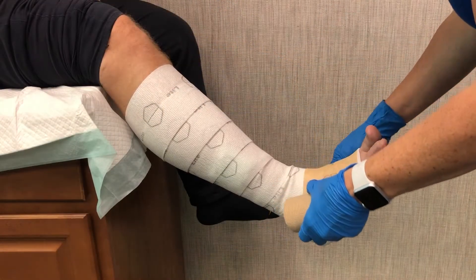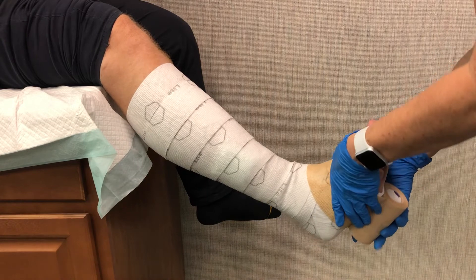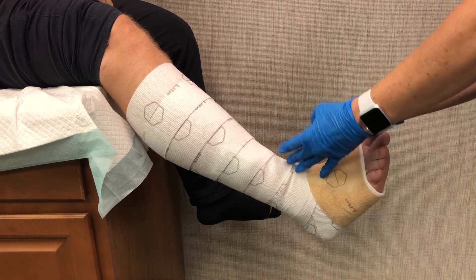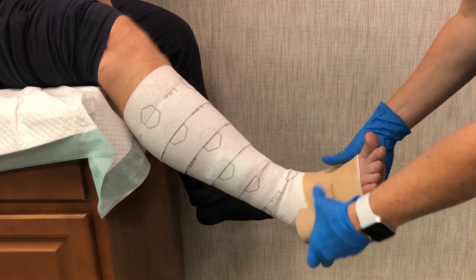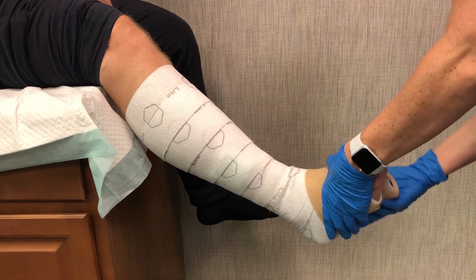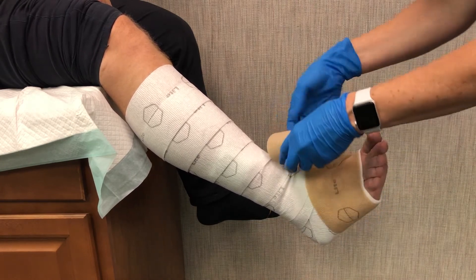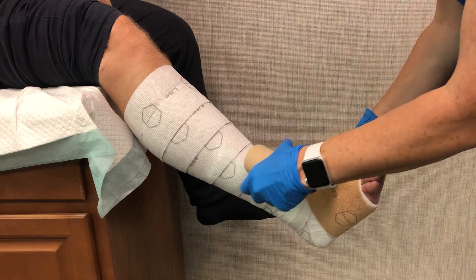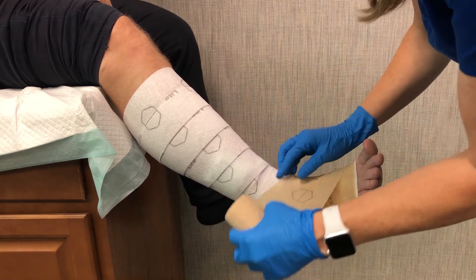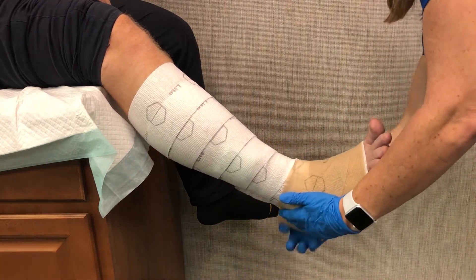Layer 2 is a cohesive elastic bandage which is thin and conformable for easy application. It sticks to itself and to the first layer, which secures the system in place for up to 7 days. As with the padding bandage, start applying the cohesive bandage proximal to the base of the toes and ignore the indicator at first. After 2 turns for fixation, wrap the bandage across the back of the foot and include the heel using a figure 8. Wrap the foot by pressing adequately while considering the anatomical, non-cylindrical shape of the foot.